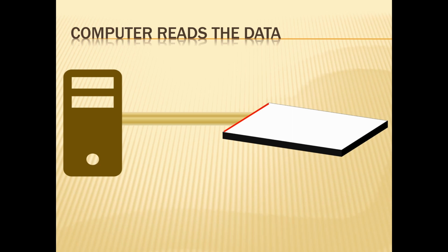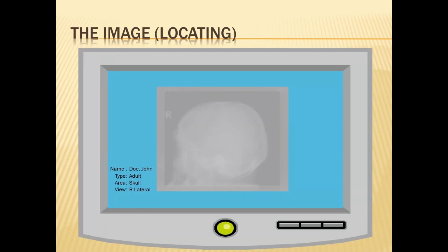The imaging plate is scanned by the computer and image stored in memory in the case of a DR system, or by the plate reader and subsequently sent to the computer in the case of a CR system. The image is now ready to be corrected by the computer. Some systems may briefly display the uncorrected image and then reveal the corrected image. Others will only display the corrected image. My system will illustrate all correction steps.